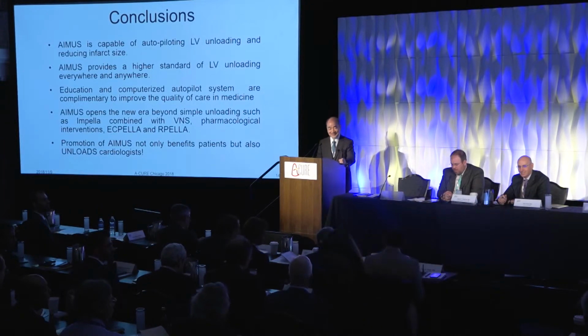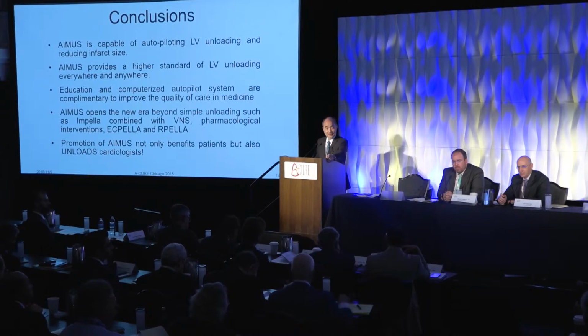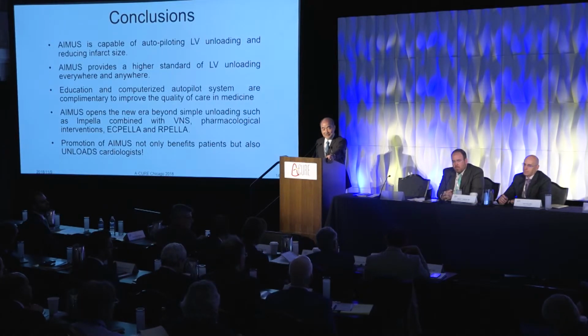So I was just asking Kenji, I thought it was really interesting about the partial and full unloading. Do you think that this concept of creating a smart pump and having longer periods of sustained unloading is superior, or do you think that having the myocardium work and then rest and then work and then rest is better? So could you rephrase your question again?